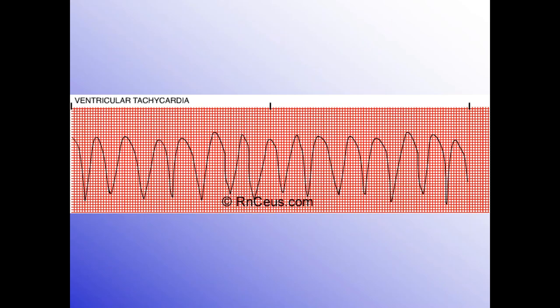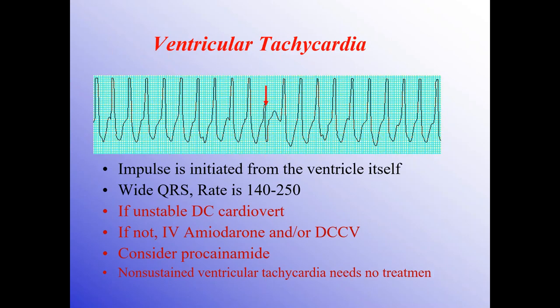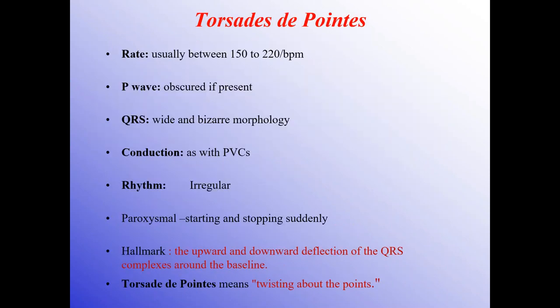So this is basically an example of ventricular tachycardia. You see there is a bizarre QRS happening. You can't see the P wave. Important sometimes in these patients is that you can appreciate some fusion beats. In between, when the ventricular tachycardia is occurring, there can be a place where the ventricle got all the time in this world to communicate, and there are some impulses which have been sent down. So you are able to appreciate and see one of the QRS complexes.